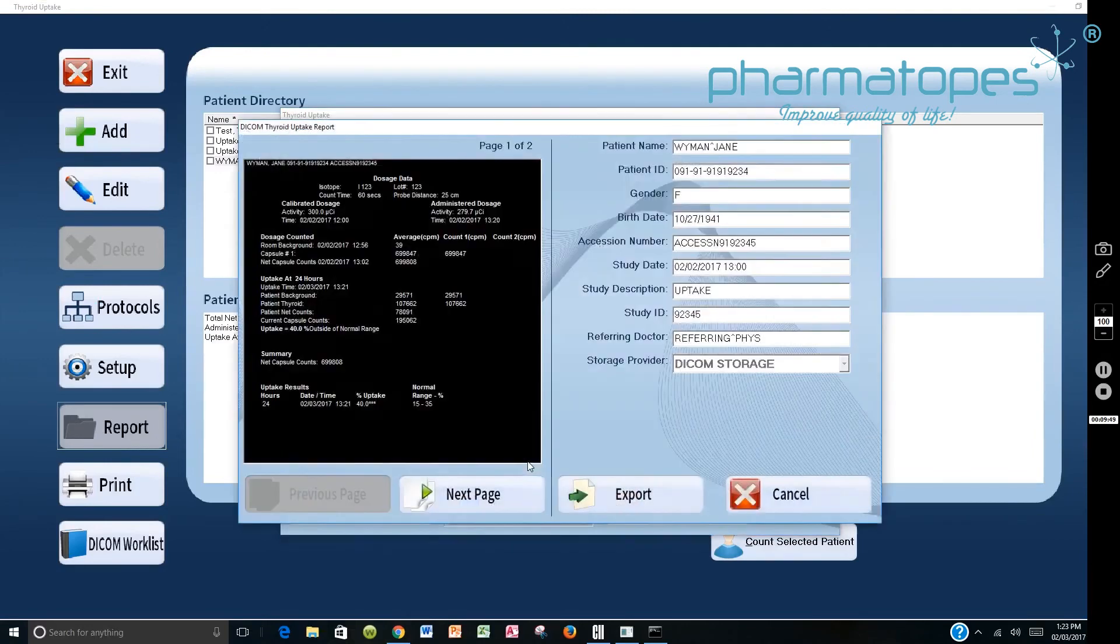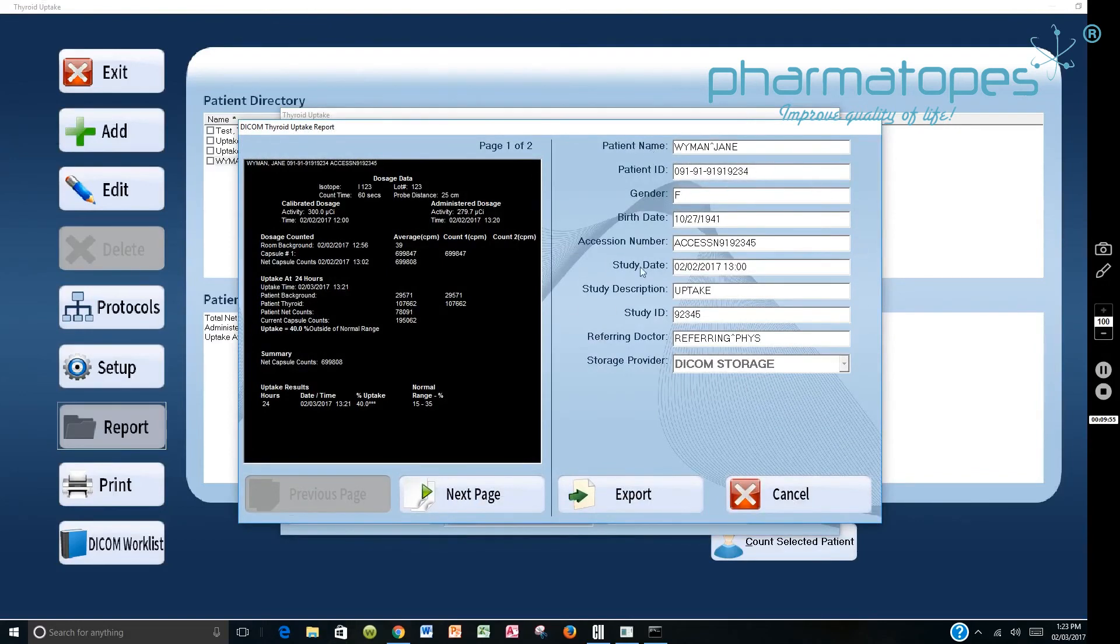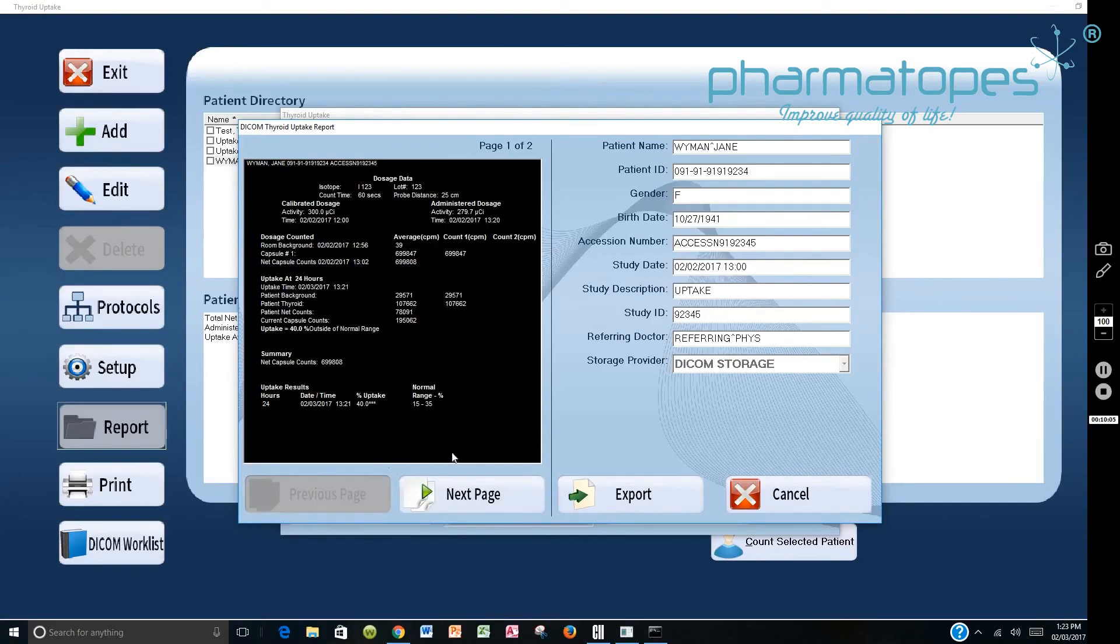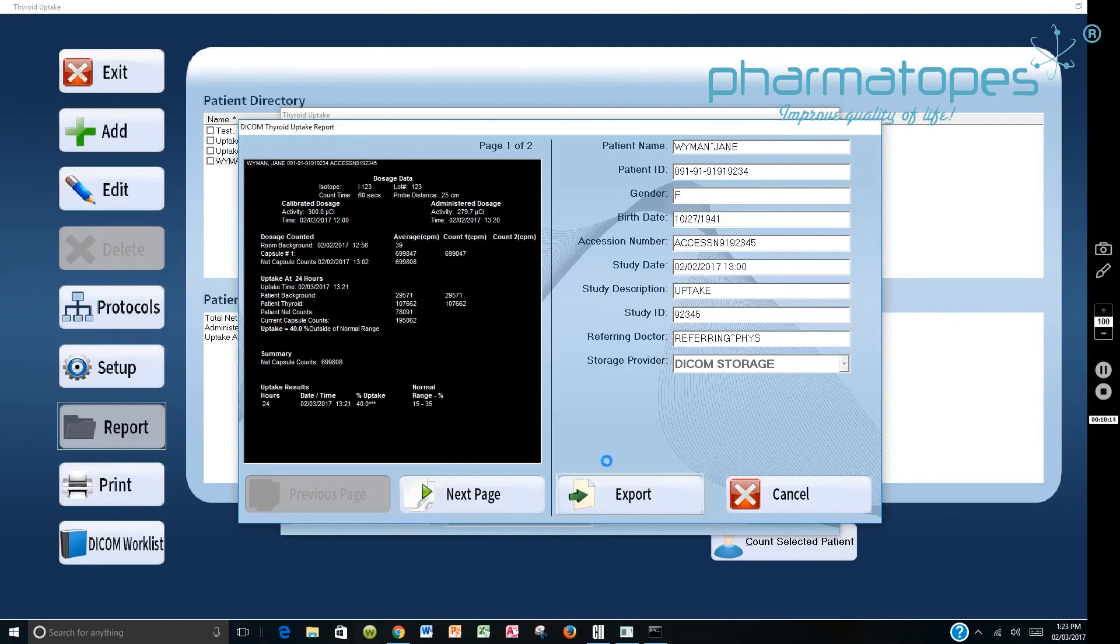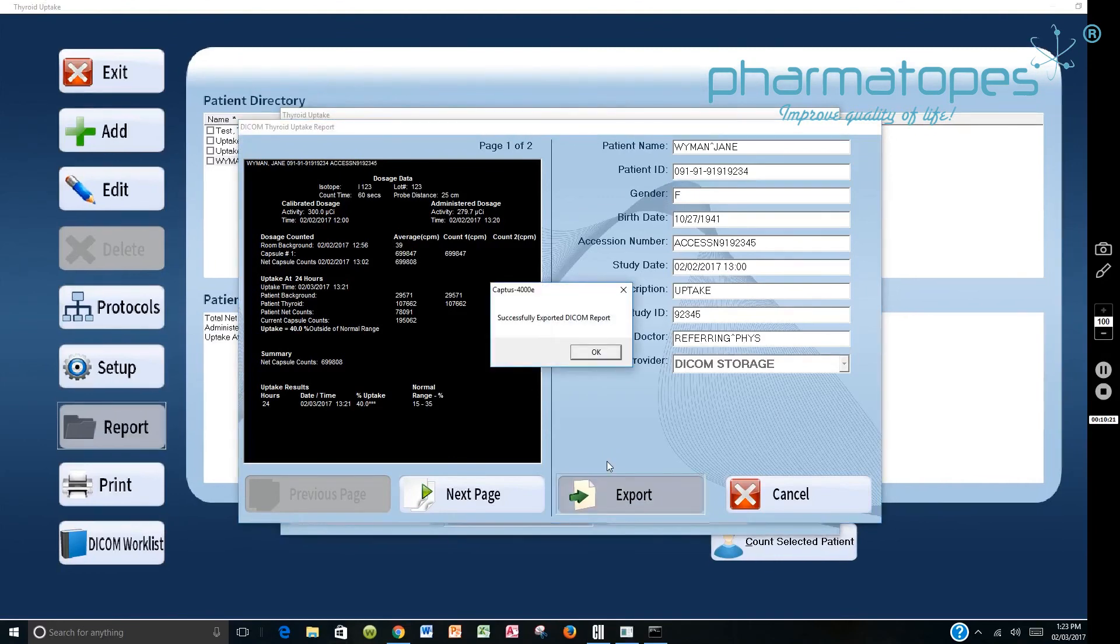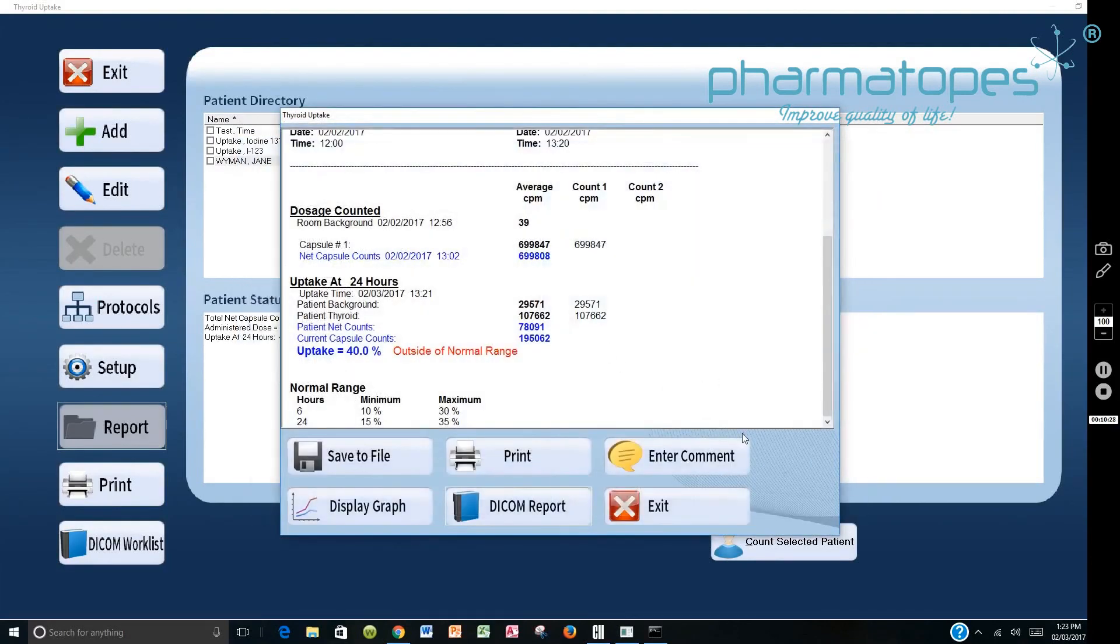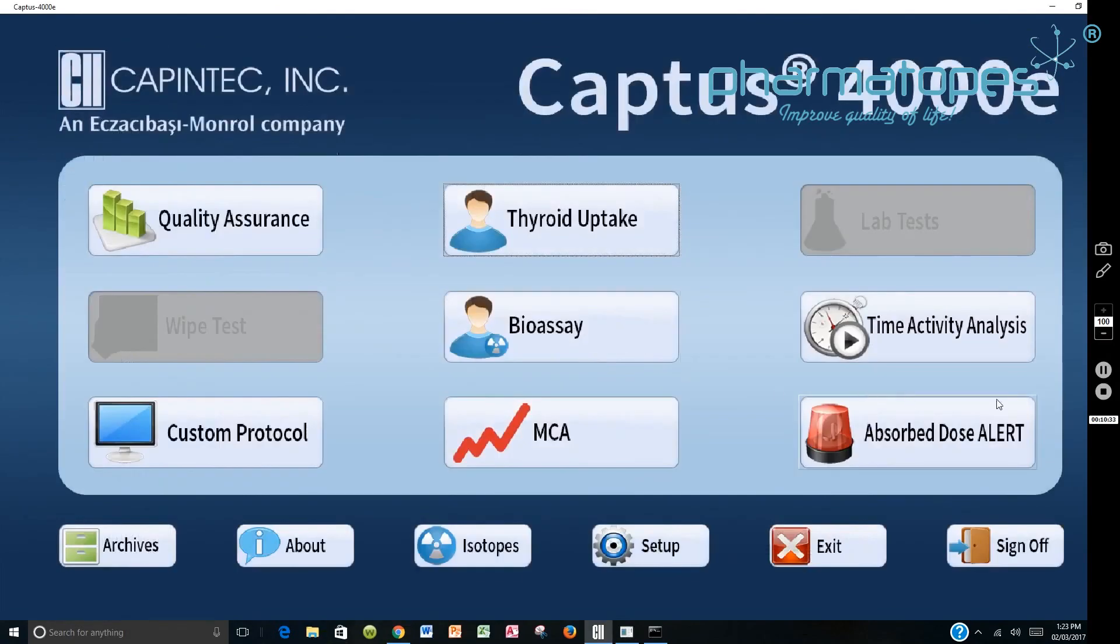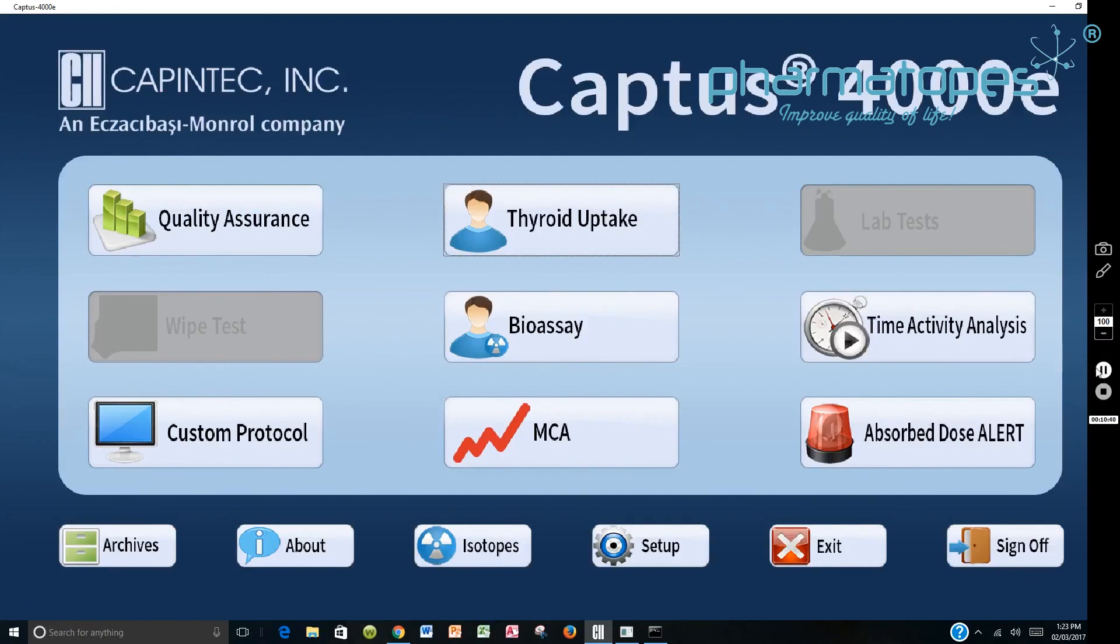So we select DICOM report. It brings up the DICOM report with all of the necessary information. If any information is missing here, it will have to be put in. And we can look at page one and we can look at page two, which shows you a graphic display of the information. So now that you have this information, you can now export it over to the DICOM server. So you would say export. And the report now will go to the DICOM server. And when it finishes that report, it will come back and say it was successfully exported to the DICOM server. So you can just say OK on it. And then you can exit back out. And then you can exit back out to the main screen. And that's the DICOM module and what it allows you to do with regards to thyroid uptake patients.